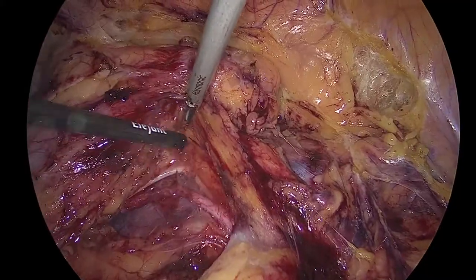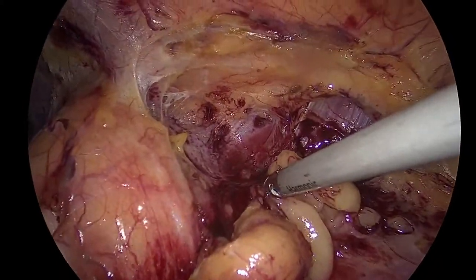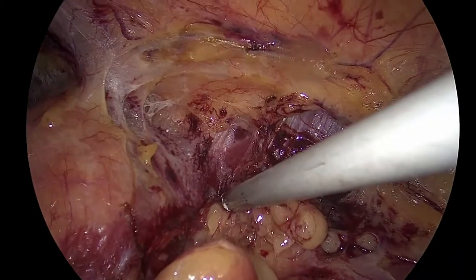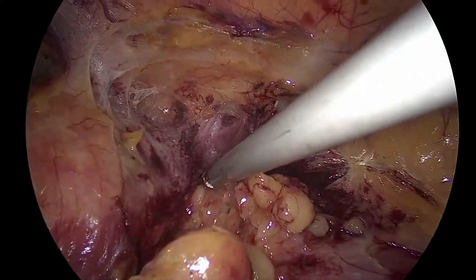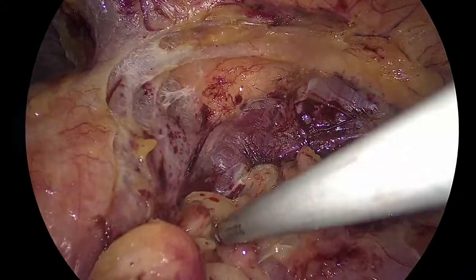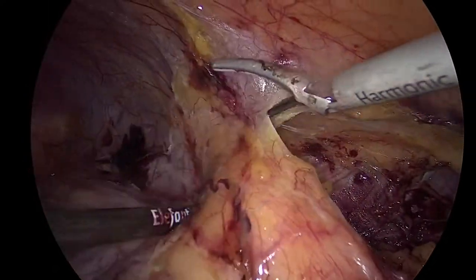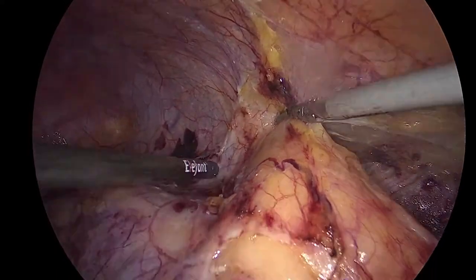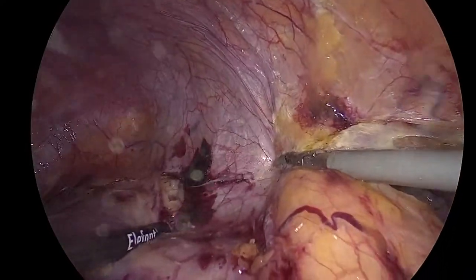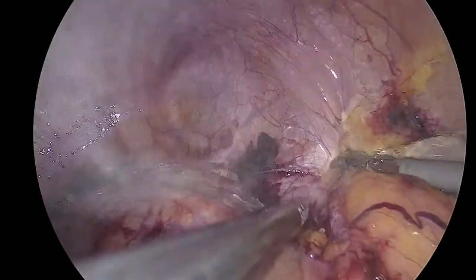So, what I do here is I always come back. Come back here. Come here. Good. I always mobilize the whole thing. Nicely here. Yes, like this. You can see there's a lot of tissue that is holding your kidney, eh? You don't need it. You need your kidney to be mobile and your assistant. Look at it. Where is my upper pole? Show me the upper pole. There. Look, all this tissue is holding it.